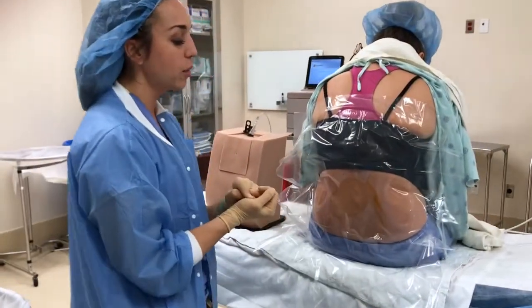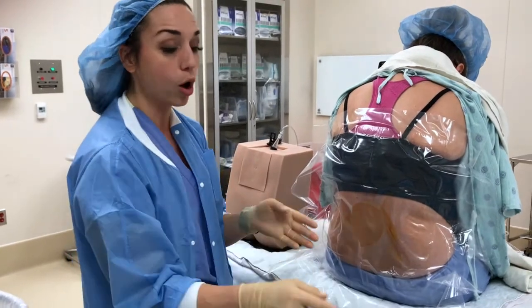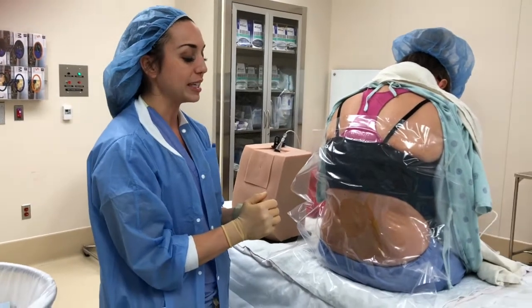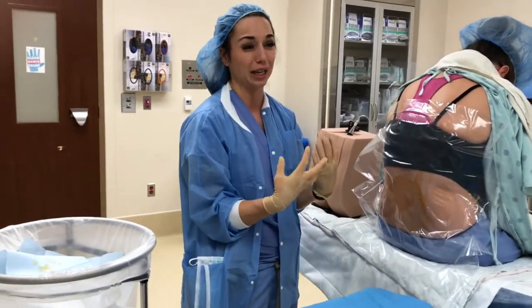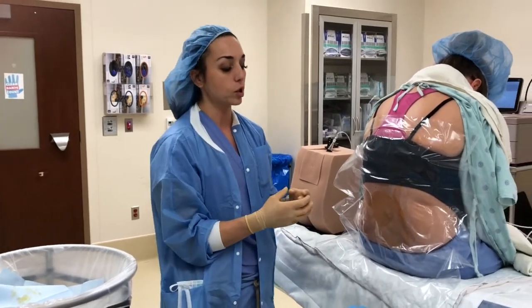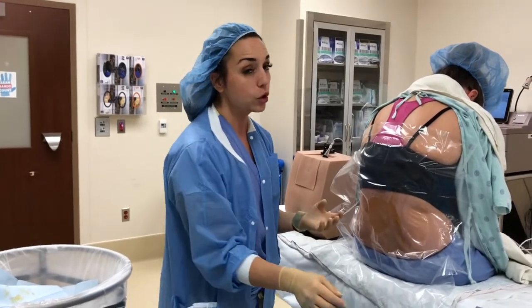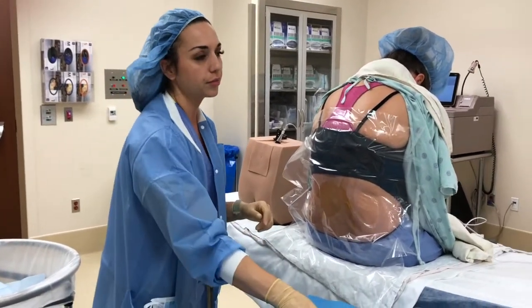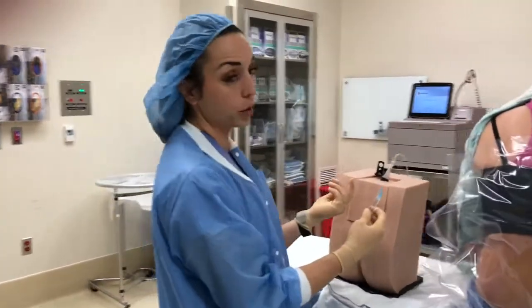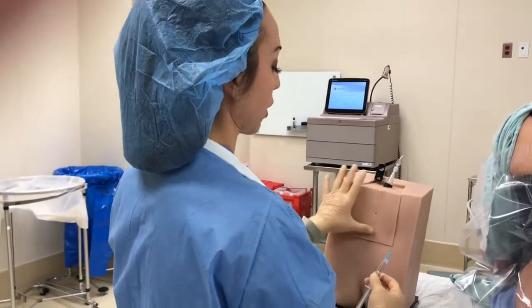So I always tell my parturients that the lidocaine is kind of the worst part. It's a small needle, but the lidocaine burns and stings, and you'll see that when these patients first get their lidocaine doses, they're going to kind of wince. So usually I'll try to remind them that's going to be the worst part. So the best thing that you can do for yourself is make a good skin wheel. You're going to hear that term a lot, making a good skin wheel. How you go about doing that, again, everyone has a little bit of a different flavor on how they like to do it. Some people, I'll show a couple techniques. I'll go down here, even though that's not the correct space, just so you can see.